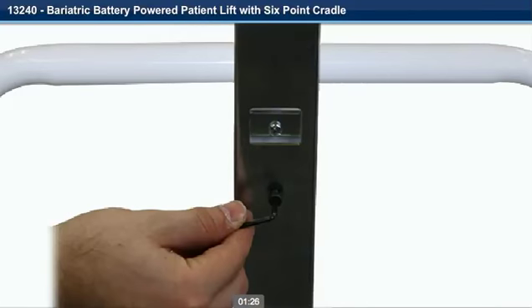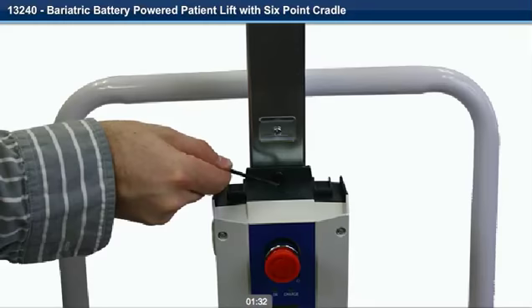Step 9. Remove the small screw from the mounting bracket. Step 10. Slide the control box onto the lower bracket and install the small screw previously removed.